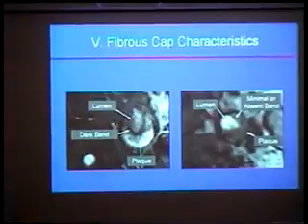On your right here is another lesion. This is where the lumen is, and this is where the original wall is. And this gray area is the lesion bulk. And if you compare this image versus this image, you realize that this dark band is not visualized. We usually label cases like this, where the lumen boundary is still relatively smooth but we cannot see this dark band, as having a thin fibrous cap. In other words, the cap thickness is below the spatial resolution of the MR images we can get.